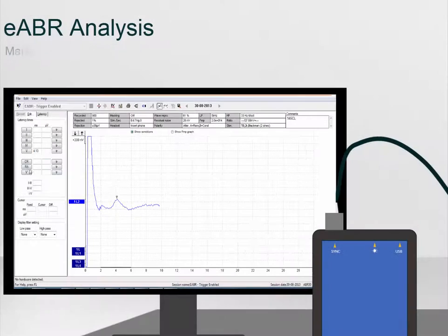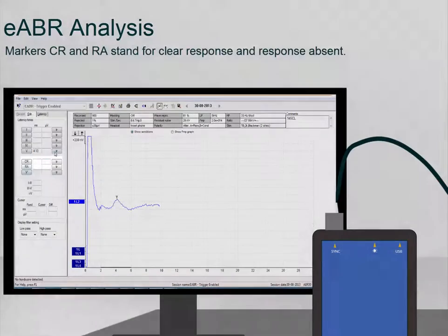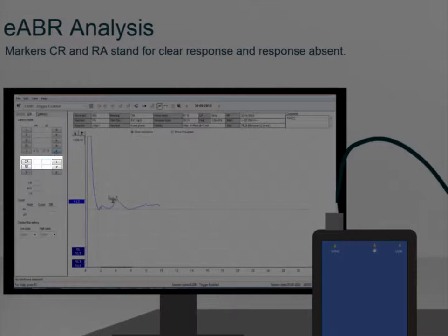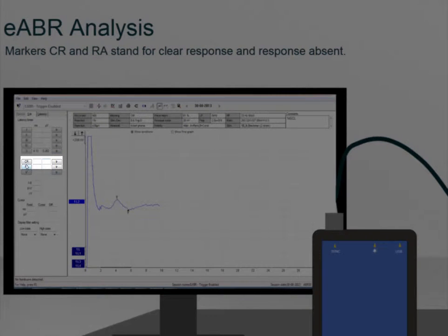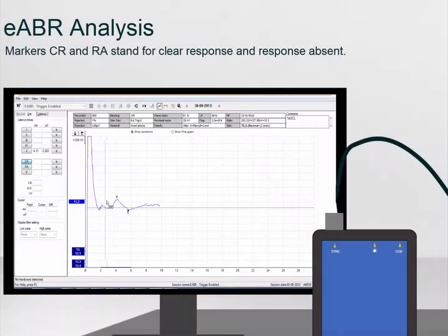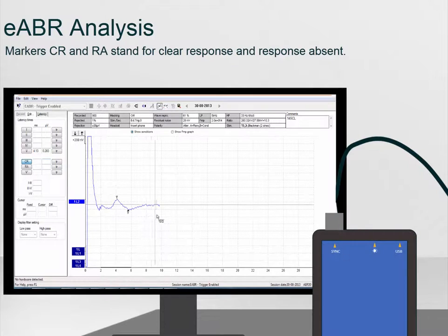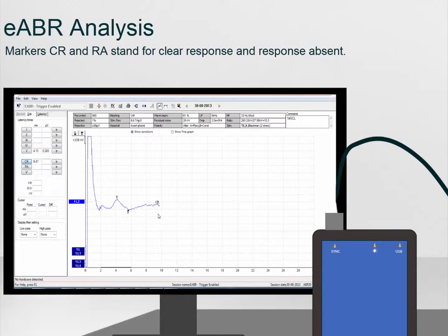The waveform markers CR and RA can be used to represent a clear response or response absent eABR waveform.